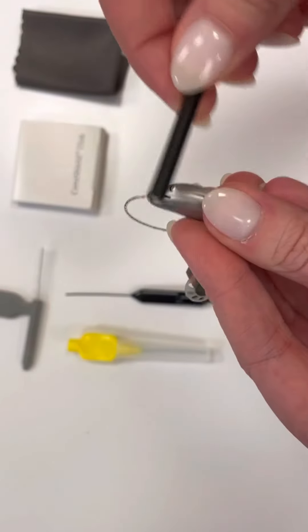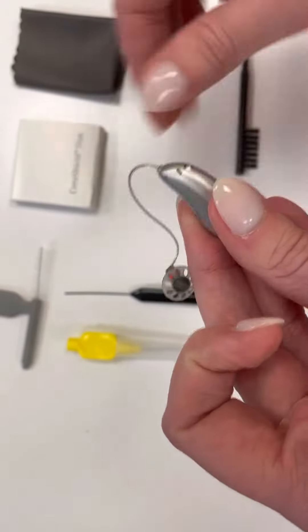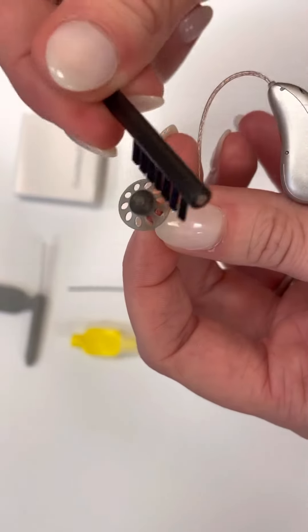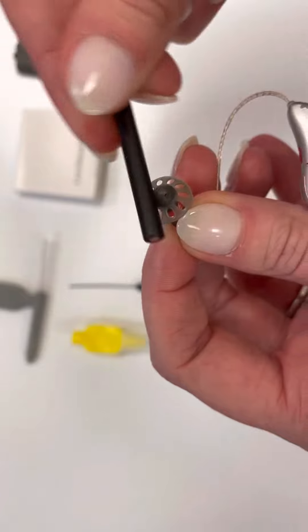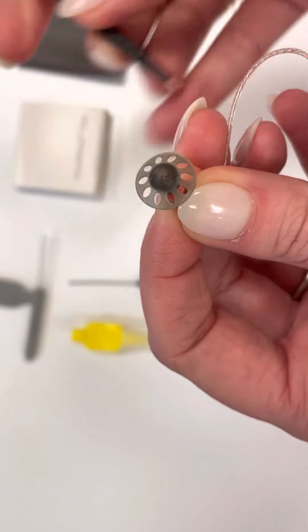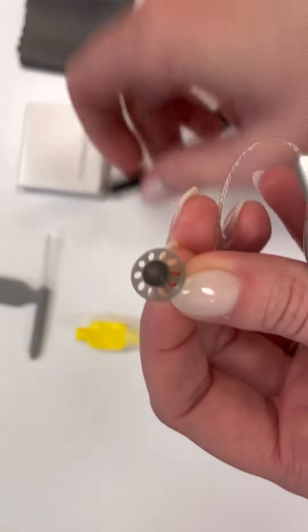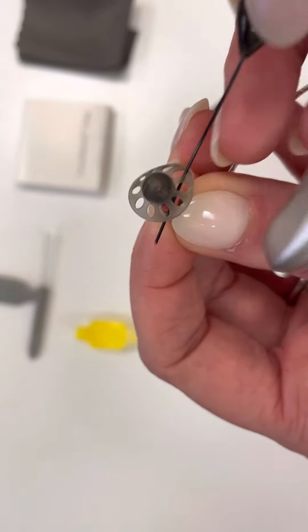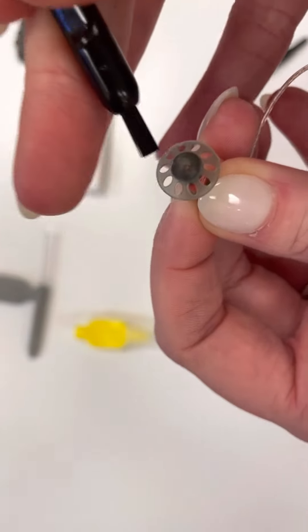So I'm just brushing it. And then you also want to brush this part. This is the dome that goes in your ear. You can use this brush and brush all the little holes. This has a pick on it — you can go through all these little holes, or something like this, just to get all the loose stuff out.